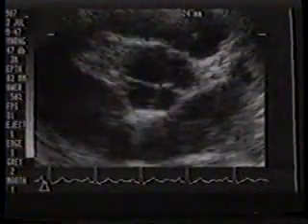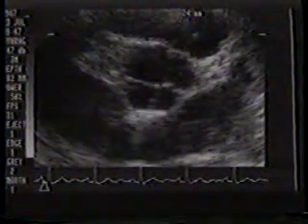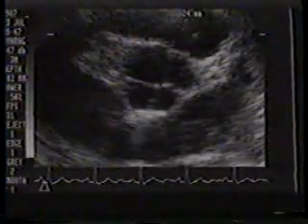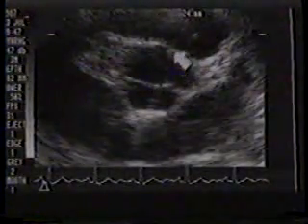This is another example of quadricuspid aortic valve. Here the four cusps are of approximately equal size. Therefore, in diastole, the valve closes with a letter X appearance. Using a frame grabber, we have now captured and simultaneously displayed the opening motion of a normal three-cusped valve, a bicuspid valve, a unicuspid valve, and a quadricuspid valve.